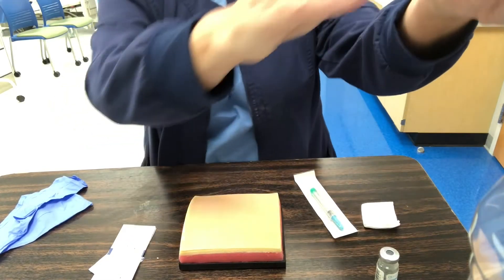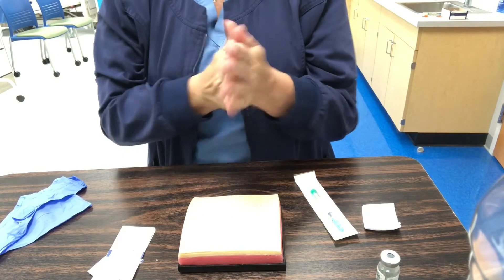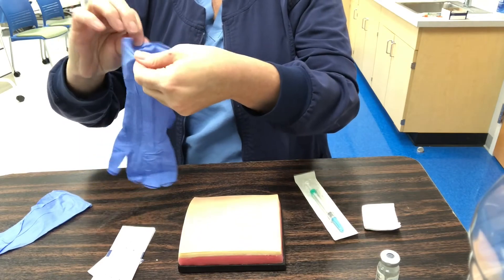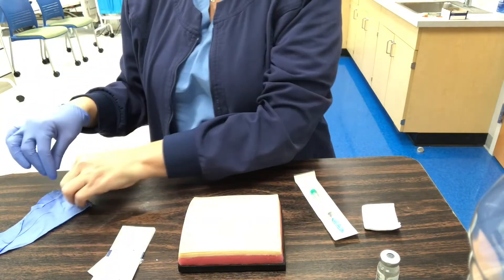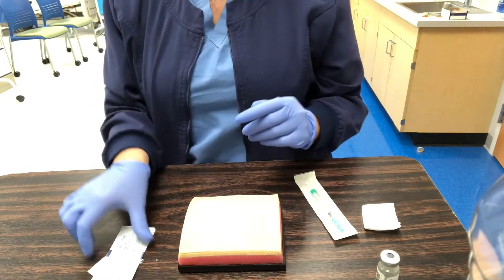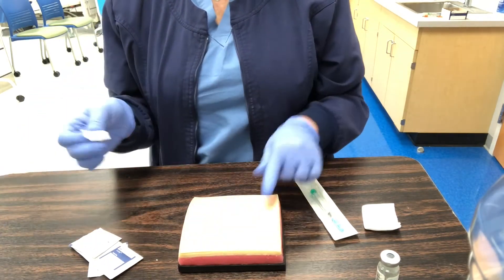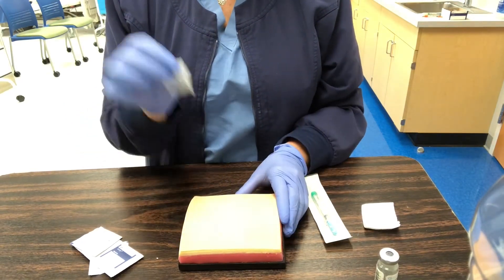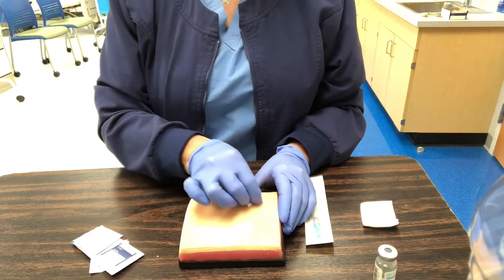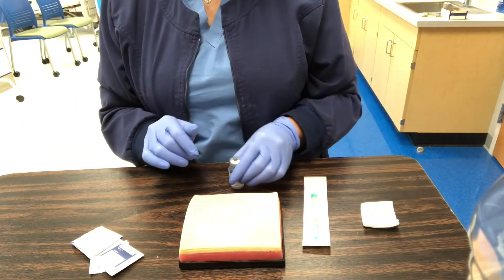I'm going to go ahead and wash my hands — I'm using hand gel — then put on my gloves. I'll take an alcohol wipe and clean the injection site in a circular motion, starting from the inside and going out. Make sure it's good and clean. As it's drying, I'm going to draw up my medicine.